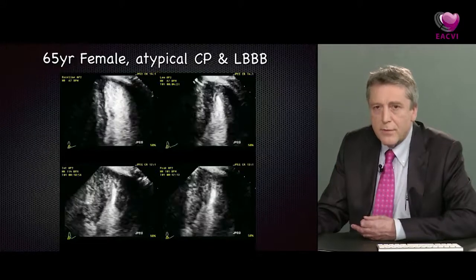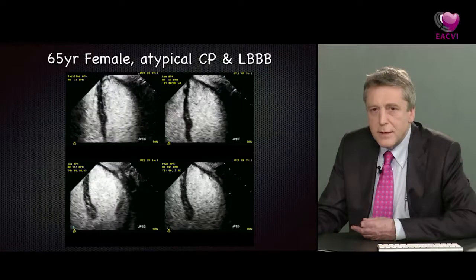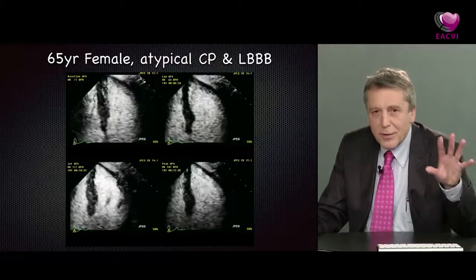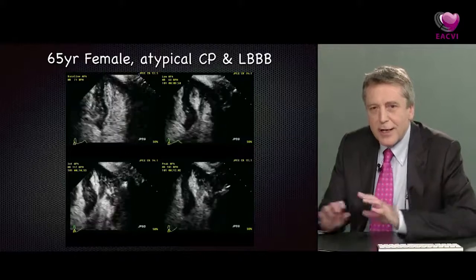And here's the four-chamber view. Now, I know in reality you'd probably stare at these images for a little bit longer, and I certainly would in a patient with left bundle branch block because they're challenging, but we don't have that opportunity now. So I'm afraid you're going to have to vote in a second.